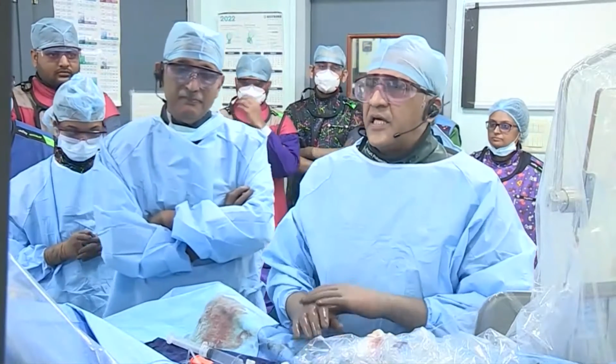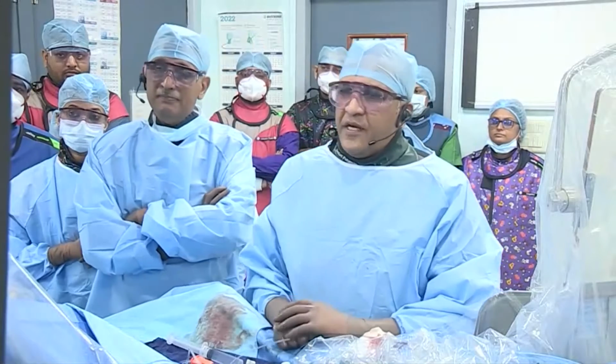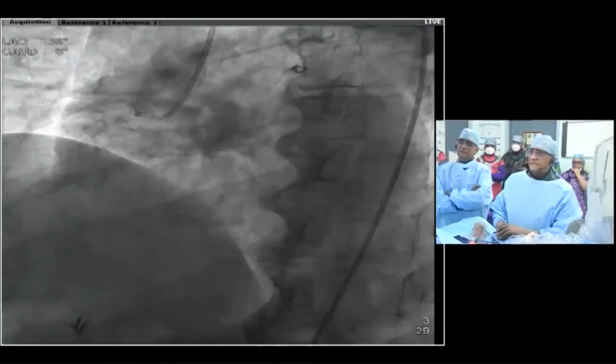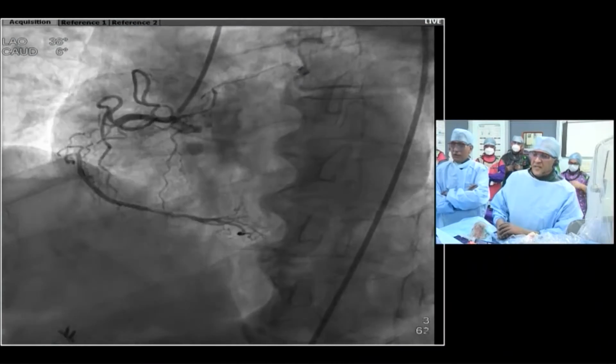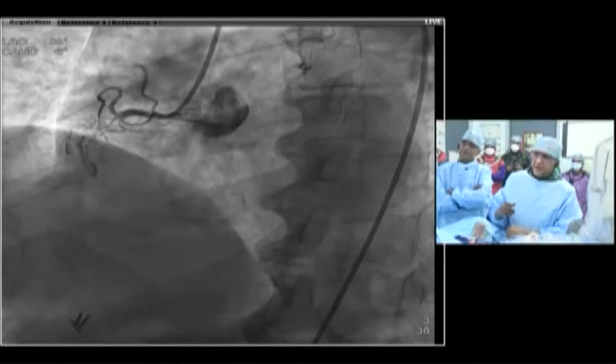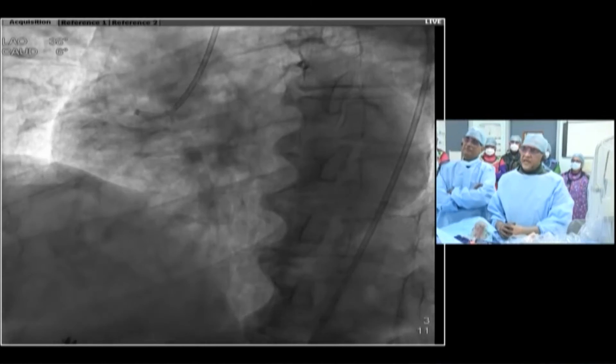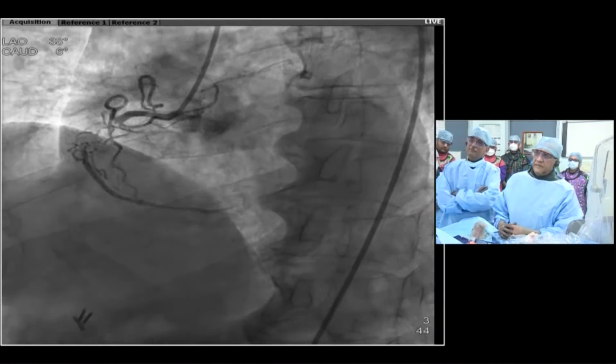Now, his coronary anatomy, can you see the angiography on the screen? Now we don't see slides. The slides are not transmitting. Unable to project the slides for some reason from here, but I'm going to show you the angio that we had this morning for you. So can you see the angiography now, the right coronary artery there? Yeah, we can.